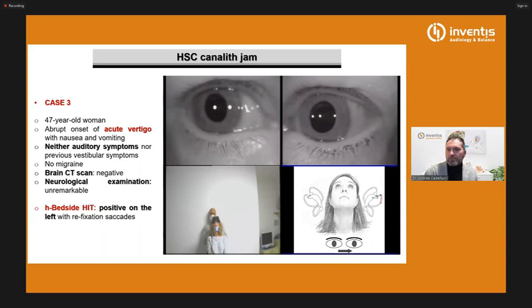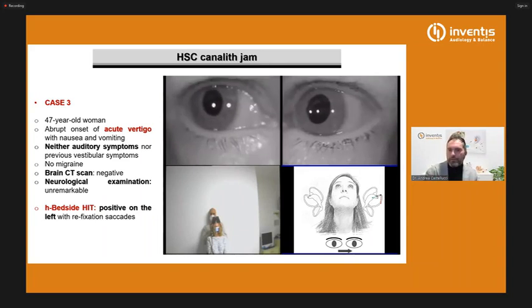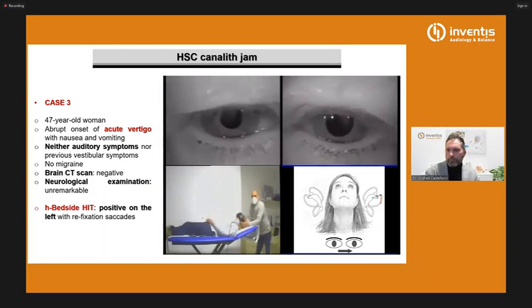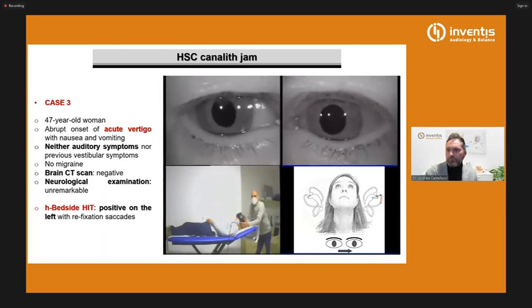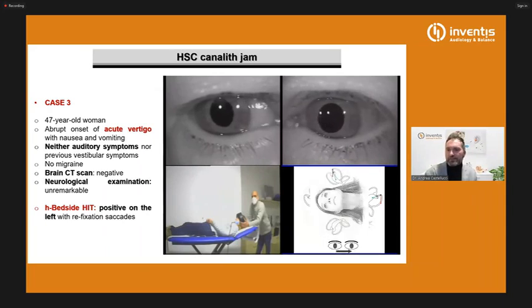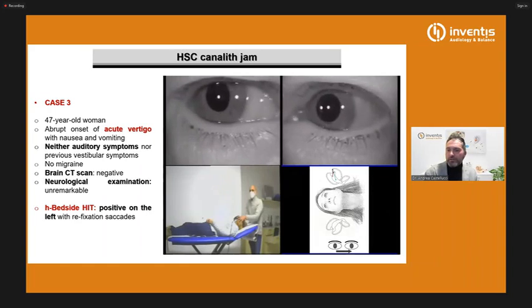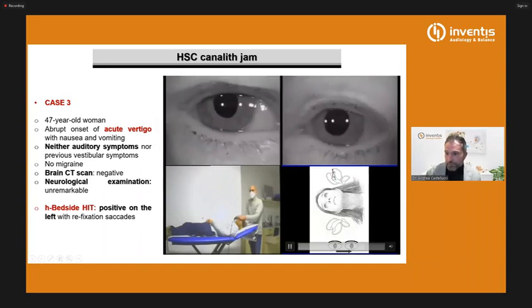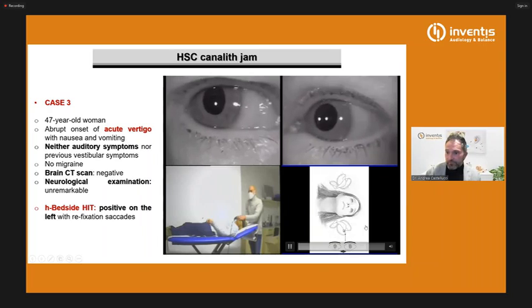Now again, we bring the patient in backward head bending, and we can see here still a left beating spontaneous nystagmus. Okay. Now Pasquale brings the patient in the supine position, and there's still a left beating spontaneous nystagmus. Now he brings the patient on the supine head roll test on the right side, and you can see here how nystagmus slightly increases, because in this position there's a positive pressure on the cupula that adds up with the gravity vector.